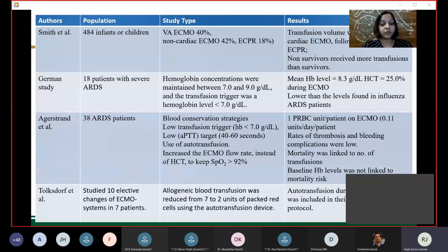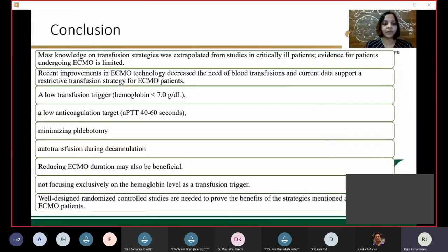Tosdorf et al. performed autotransfusion in 7 patients on ECMO, and it reduced RBC transfusion volume from 6.8 to 1.9 units. The advantages of autologous transfusion are lower humoral immune response, lower infection risk, and shorter length of hospitalization. In particular, the authors found that the depletion of leukocytes and platelets using cell saver, in contrast to whole blood out of heart-lung machines in cardiac surgery, can reduce inflammatory response and improve lung function after transfusion.